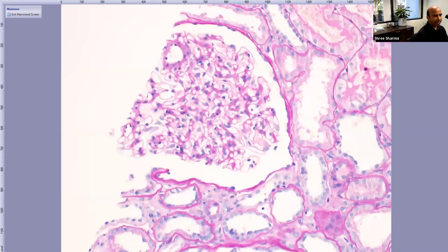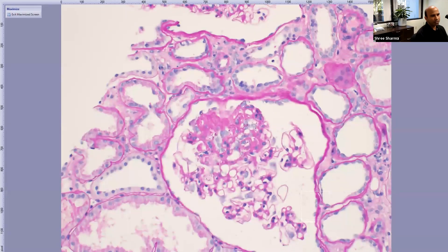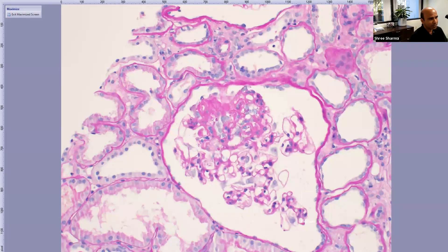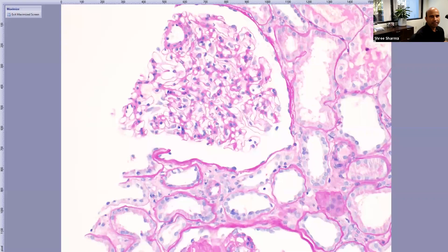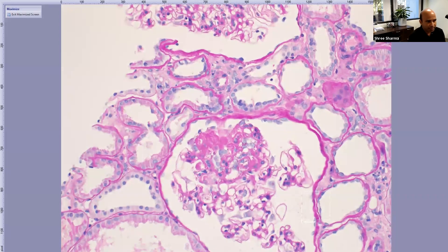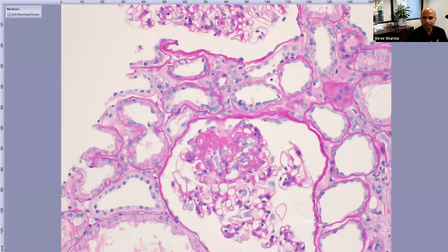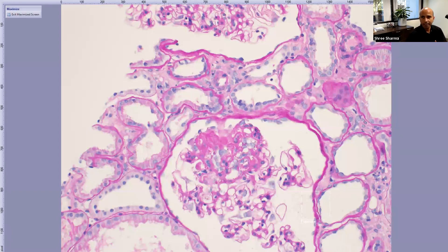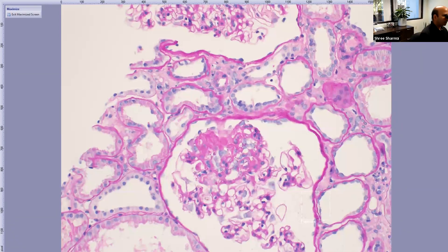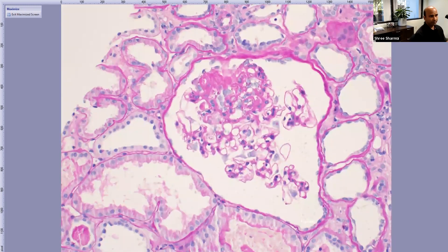In the next field of the same case, there is a lesion — the chat correctly identified FSGS. We have segmental sclerosis and glomerulomegaly: two findings in one case. This combination tells a story pointing toward adaptive FSGS, such as that seen in obesity or a solitary kidney where the kidney is struggling. Glomerulomegaly combined with segmental sclerosis = adaptive FSGS.